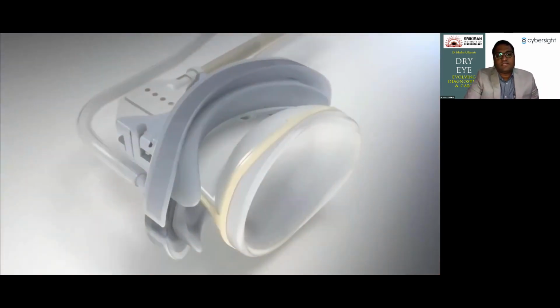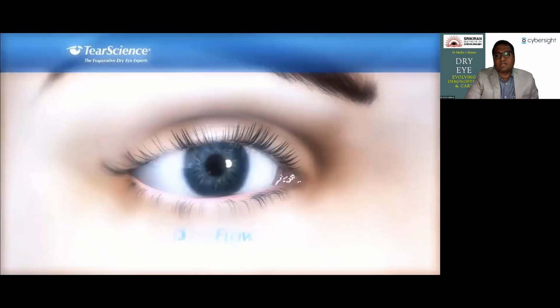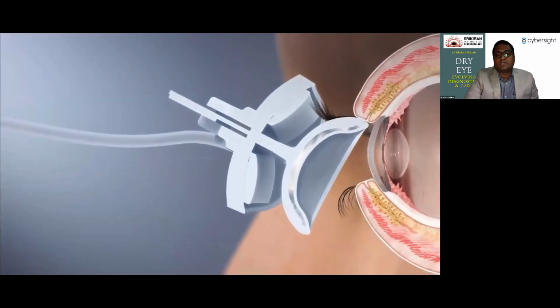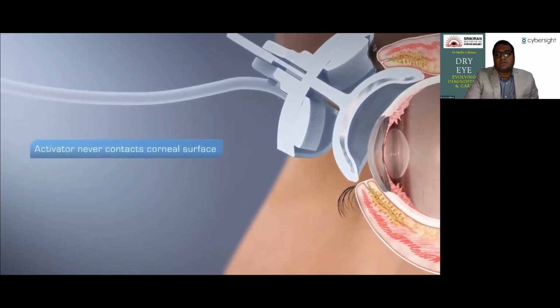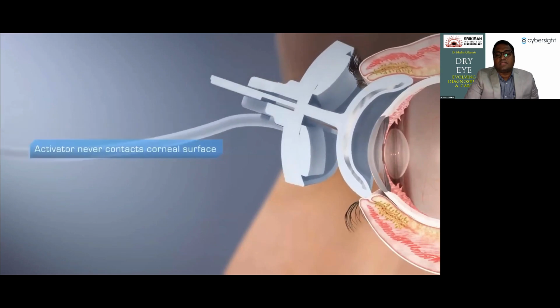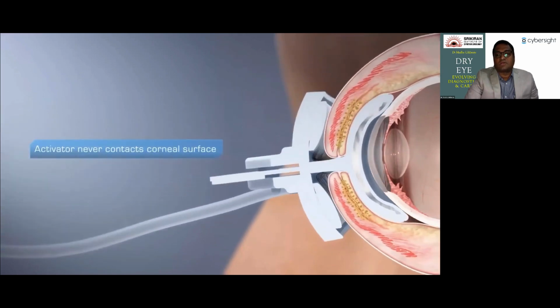If you carefully see here, that is the applicator. It goes and sits on the sclera. It doesn't touch the cornea. It sits on the sclera and its posterior surface is just on the inner side of the lower and upper lid, which starts to give a pulsation.